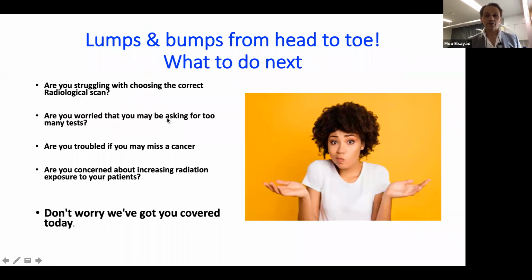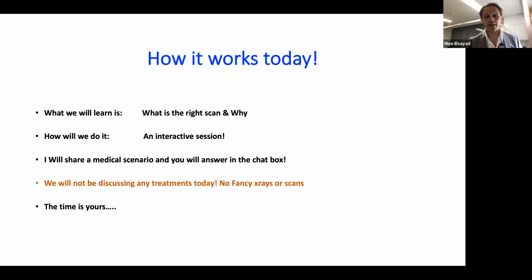Now, if you are one of these doctors or clinicians who's not sure which test to use, and sometimes you may be thinking, am I giving a lot of radiation by asking for CT scans or X-rays, or you may be really worried about cancer and you're not choosing the right test. Today, we're going to go through this. There will be a lot of opportunity for us to share our knowledge and experience and to go through different examples. So what we will learn today is what is the right scan for a lump and why.